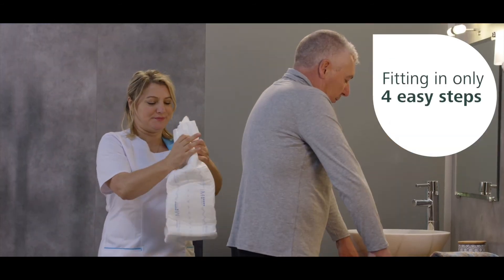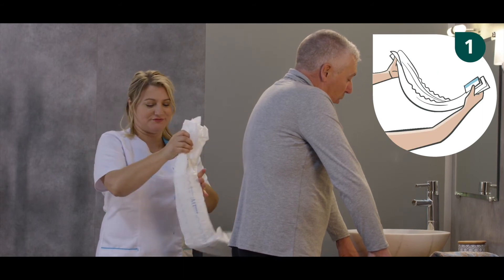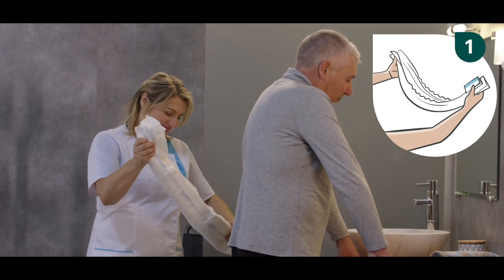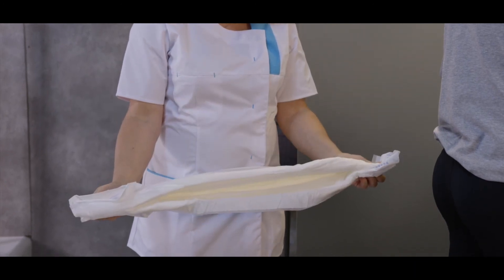The application can be performed in four simple steps. Step 1: fold the product lengthwise along the central wetness indicator. This will activate the two cuffs that run along the sides of the absorbent core. Do not unfold the side panels yet.